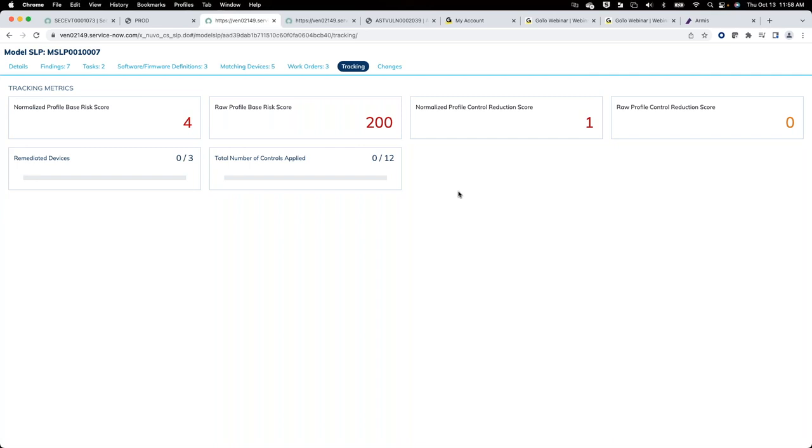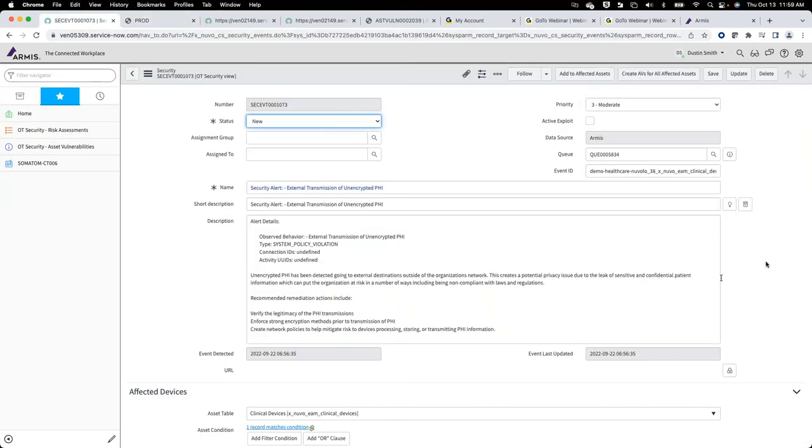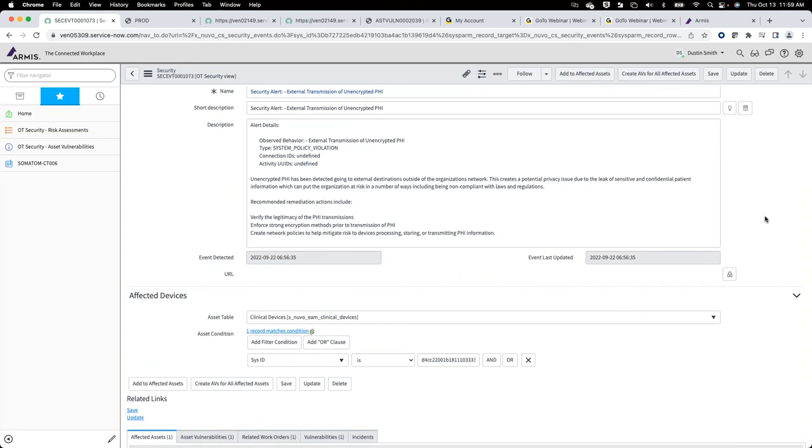One quick thing, Dustin, I want to add, we talked about risk assessment. Remember, it's performed over time. As things change in the threat landscape, we go back and make changes. So for example, if as part of the pre-procurement process, the devices in question are only going to be a handful, five of them, for a specific use case in a specific location, that's something you factor into risk assessment. But lo and behold, fast forward 12 months from now through acquisition or whatever, now you've quadrupled the number of devices and you're spread across your healthcare system. Guess what? Now your exposure is a lot greater, so it's going to impact the risk. So you can go back and start making those tweaks.